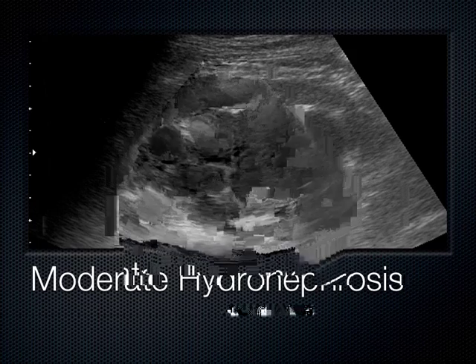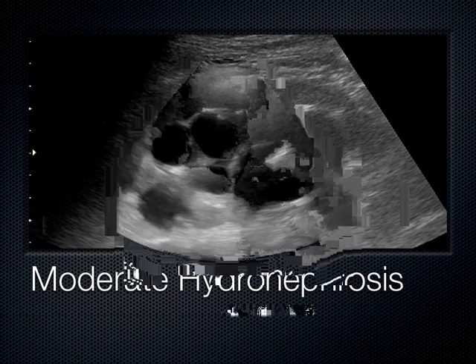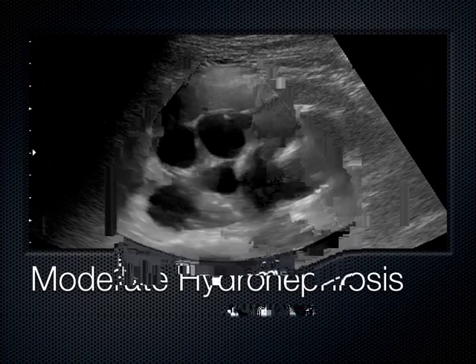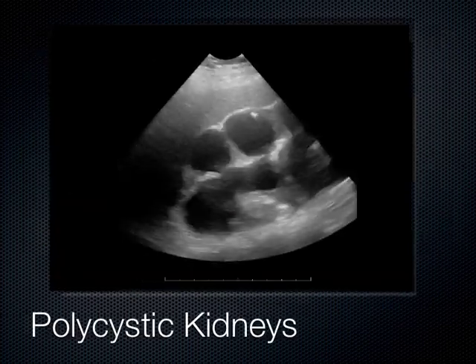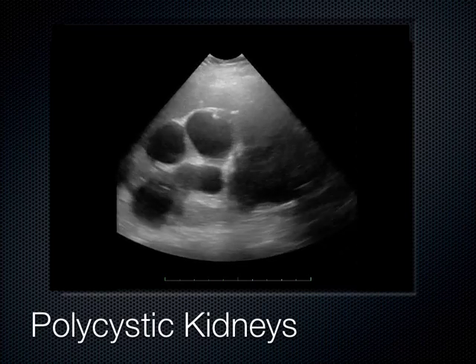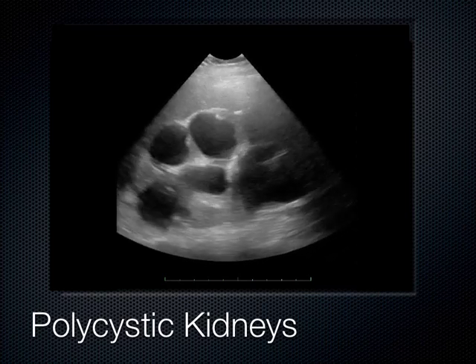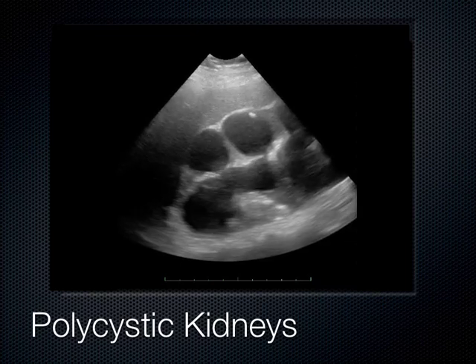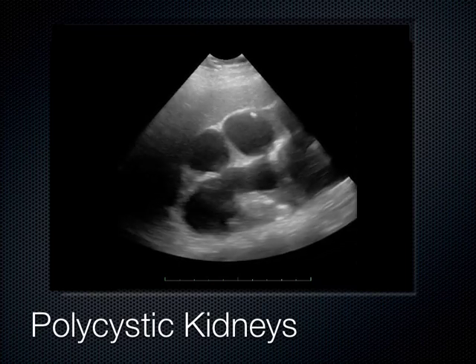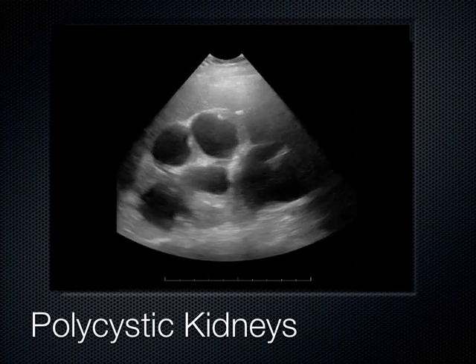Here's what polycystic kidney disease looks like on ultrasound — multiple cysts seen out in the cortex, with several visible throughout the kidney. It's bilateral and can affect other organs; sometimes you can see cysts in the spleen, around the liver, and ovaries can look similar when they're polycystic.